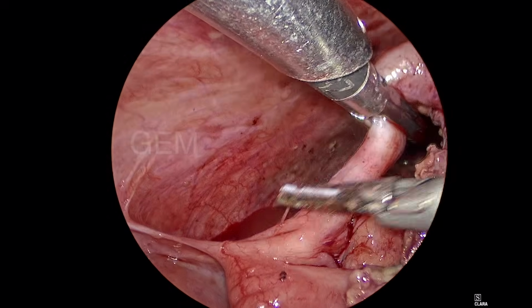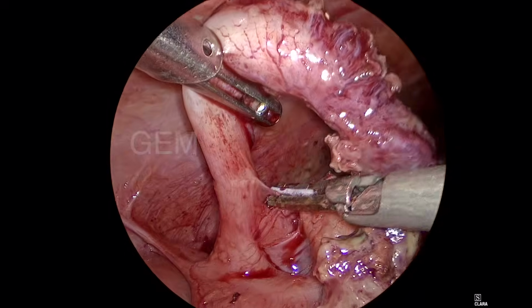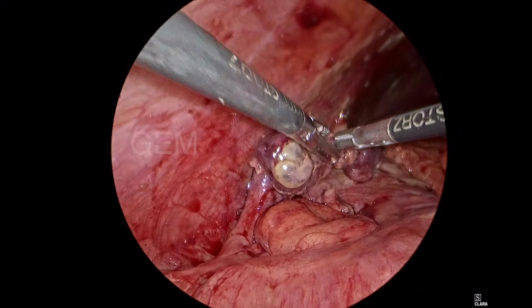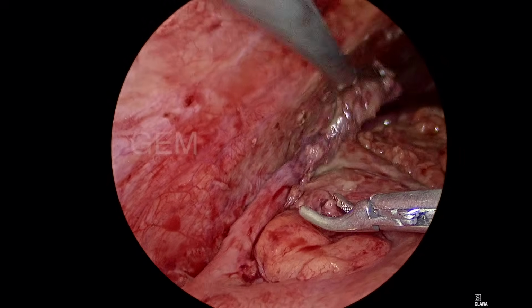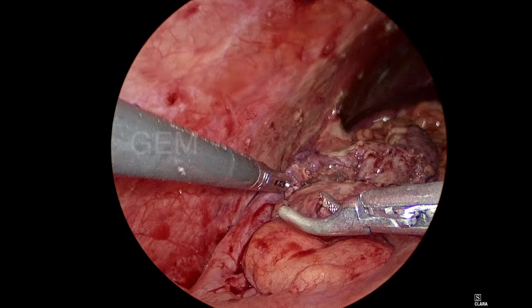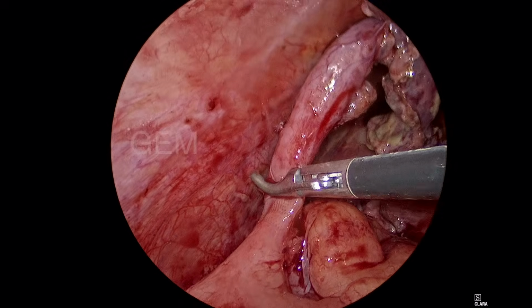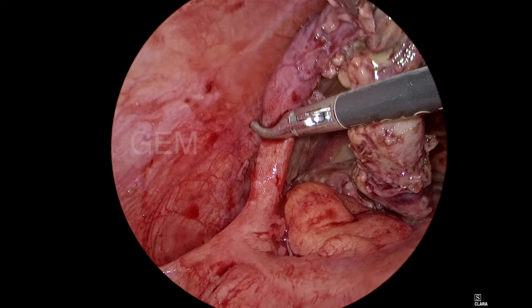Now you can see it's a little bit conical cecum. I don't want to release the cecal adhesions because the base is already reached. If I have any doubt about the base of the cecum, then I mobilize the cecum. In this case I don't have any doubt. You can see a good length of appendix is there below the level of perforation. So I am milking out all the content. I am going to apply the endo loop.